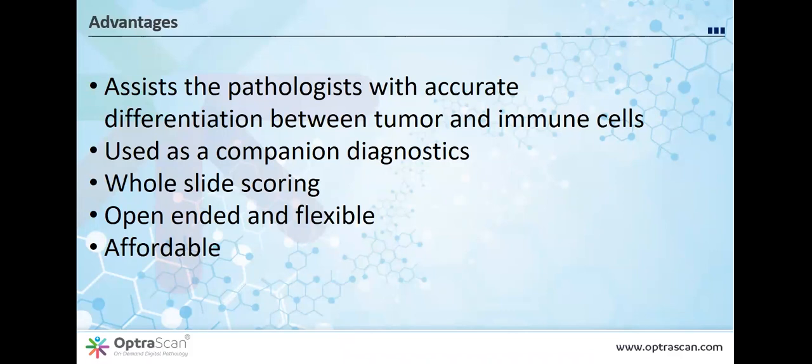And I have to admit, over the 30 or 40 years we've been doing staining, we have not paid enough attention to consistency in producing a stain of regular intensity. That's where you have to use enhanced control processes to make sure the stains are reproducible. Because if your stains vary from day to day, so will the performance of the algorithm. And so actually will your performance as a pathologist, although you may not know it.